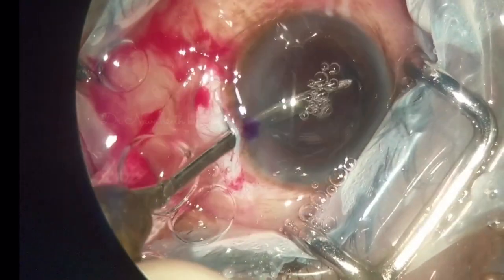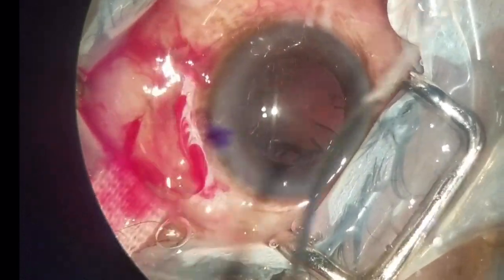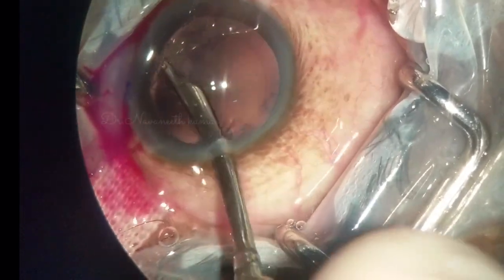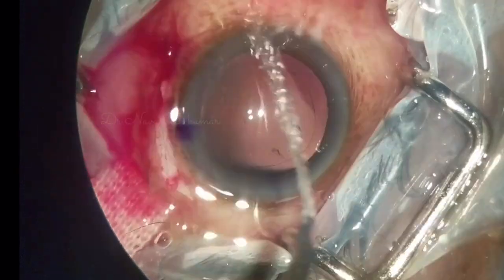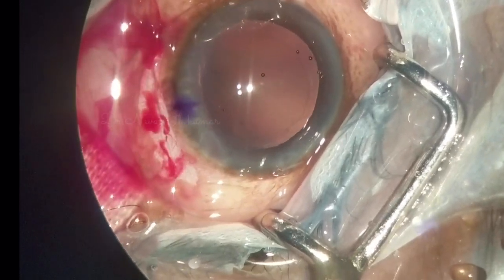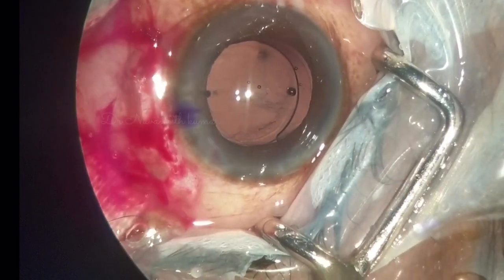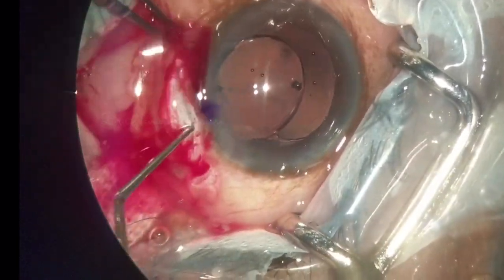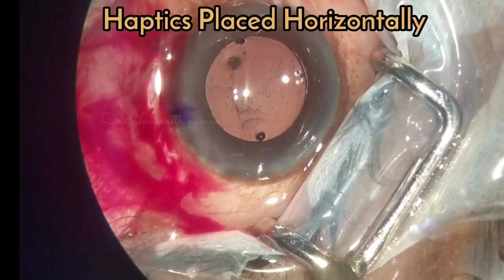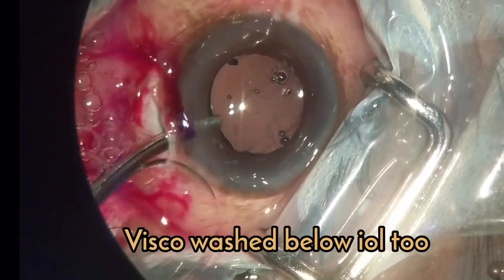Thorough cortex wash is done with a Simcoe cannula. Superior cortex fibers are washed from the sideport. After inflating the bag with viscoelastic, the IOL is implanted into the bag and the haptics dialed into horizontal position. Viscoelastic is thoroughly washed from the anterior chamber and from below the IOL.